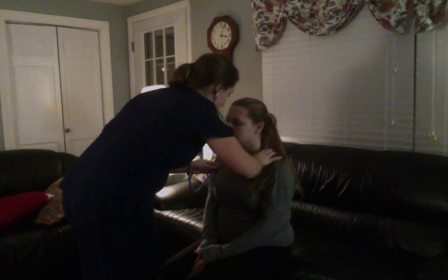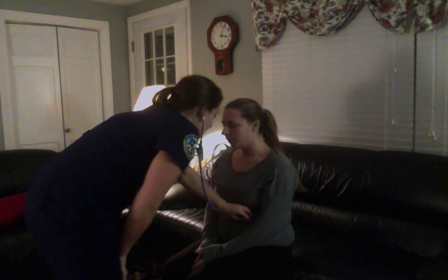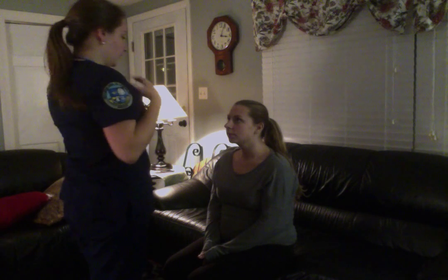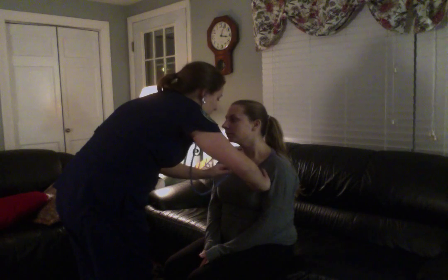I'm going to listen anteriorly to your lung sounds now. Take a deep breath in. Can you take a deep breath in? Lung sounds are good anteriorly. No wheezing or trouble breathing or no crackles. I am now going to listen to your heart sounds. And I'm going to start with your aortic in your second intercostal space.